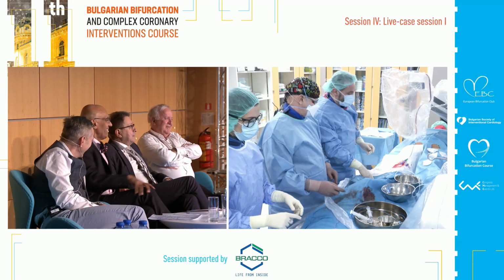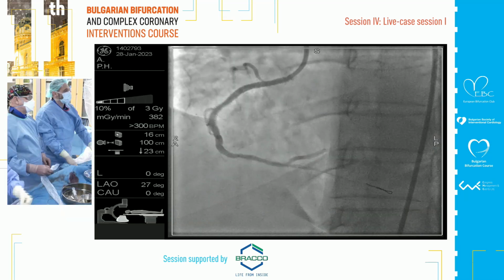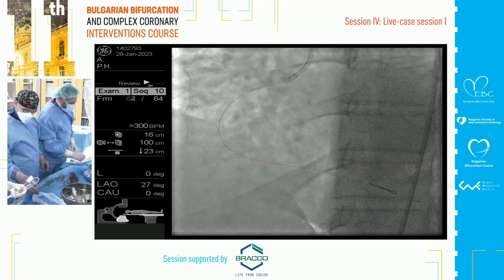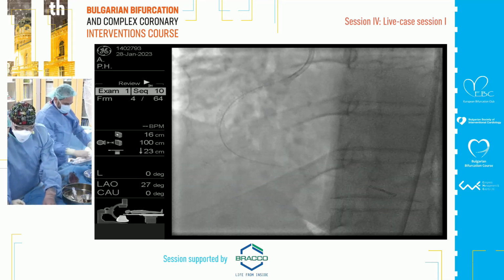And maybe we will see. By the way, right now, I saw the 1 millimeter internal gap, movement of the stent. Akiko will tell us. Yeah, I can see, and then we do the IVUS and we have all the answers. I think you can see a little narrowing. Yes, yes, we are waiting for it.